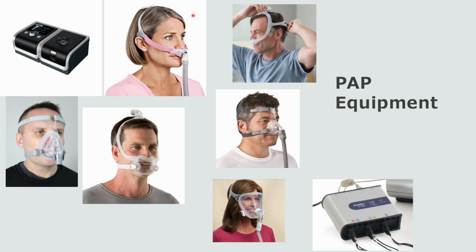Finally, the total face mask. Not the full face mask, the total face mask. It's the least used face mask. That wouldn't work because her hair is all up in that mask. But it covers the entire face.